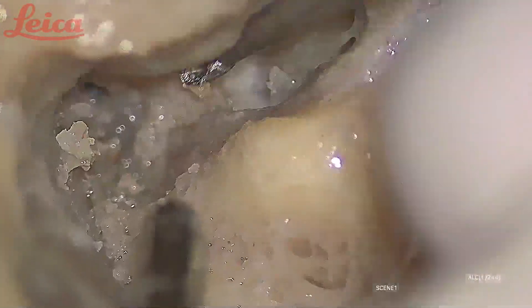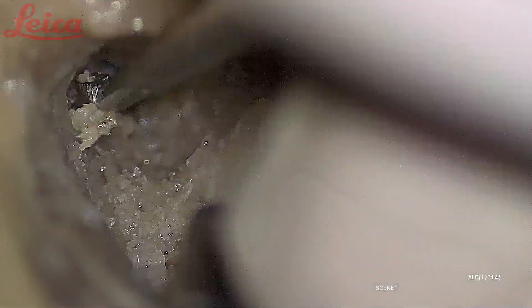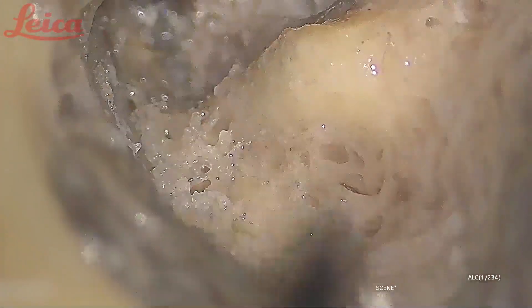Here you should also be careful about the tegmen — if the dura is exposed you should be very careful. I have gone almost up to the first genu. The bone here is thicker than what we usually see, so I am finding it difficult to curate it out. But always take your time and do it patiently.